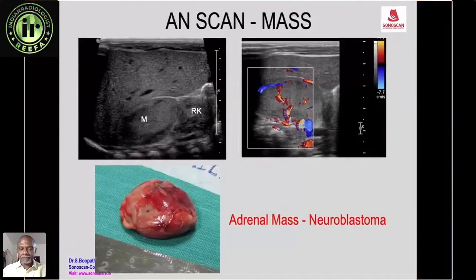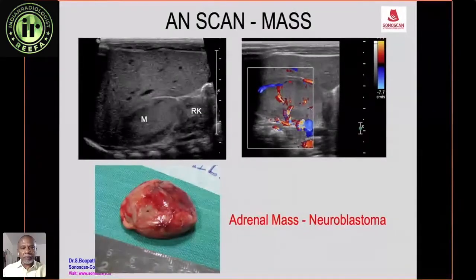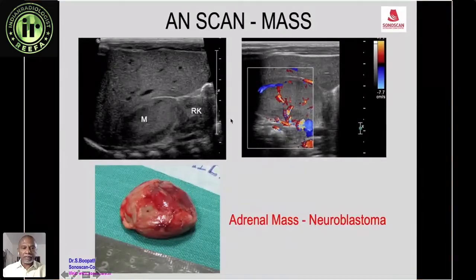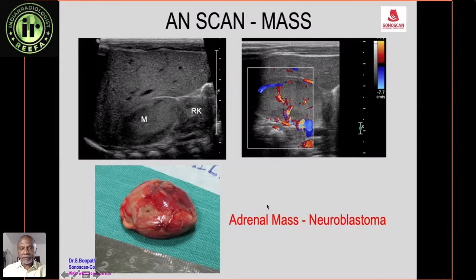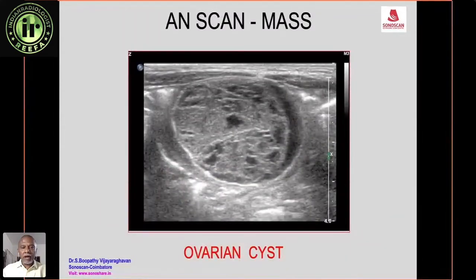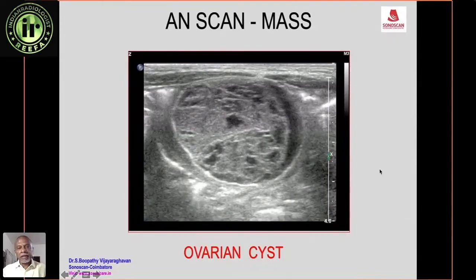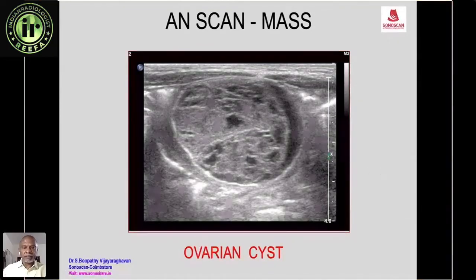This is a case of an antenatal scan reported as an abnormal mass. A mass is seen in the right adrenal area, and on color Doppler there is flow. It was removed and turned out to be a neuroblastoma. More commonly, an ovarian cyst is found on antenatal scan - here it is complicated with a lot of debris inside.